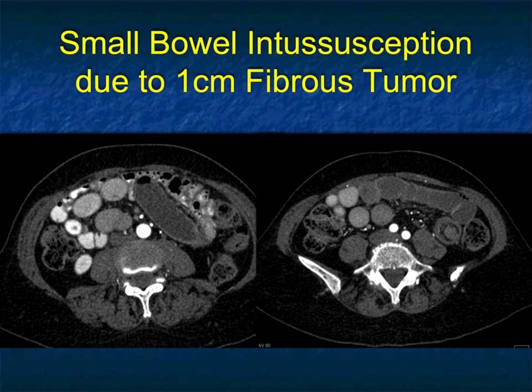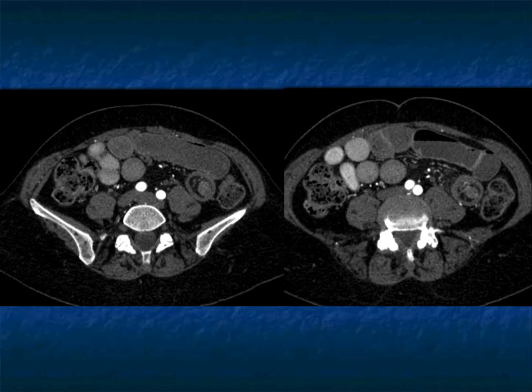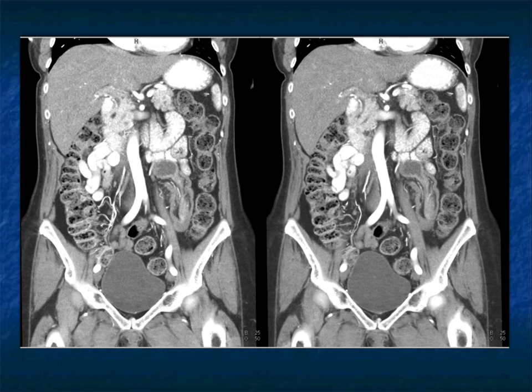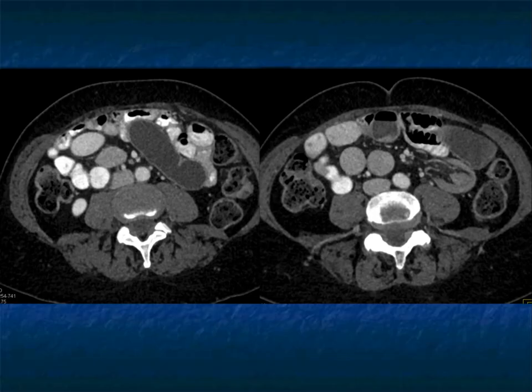Here's another patient — intussusception in the left lower quadrant with dilated bowel loops and abdominal pain. There's the intussusception, and there's the fat. This was surgically confirmed as a benign fibrous polyp. In terms of distinguishing malignant from benign — if the only process you're seeing is the intussusception, the answer is probably not possible. Obviously if the patient has lymphoma with extensive nodes or liver metastasis, that's easy. But we can say we see no reason for malignancy, though we could not exclude it. This patient had surgery, the tumor was resected, and did fine.